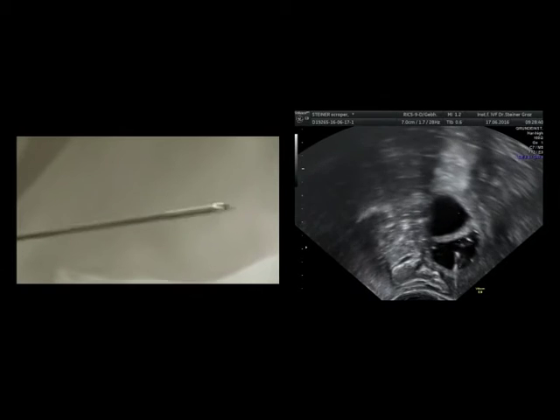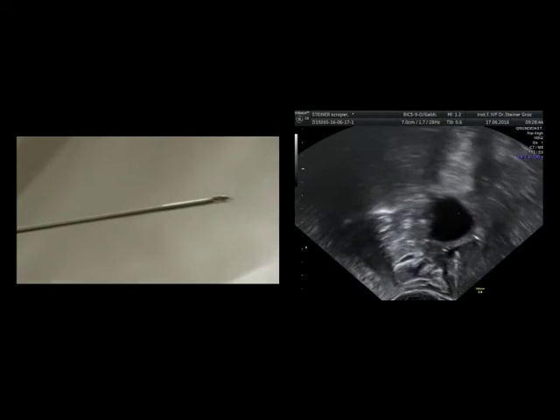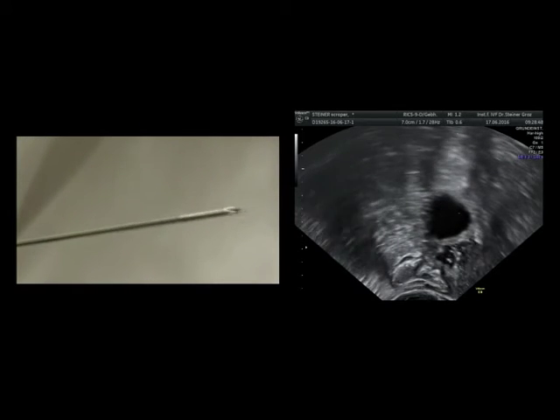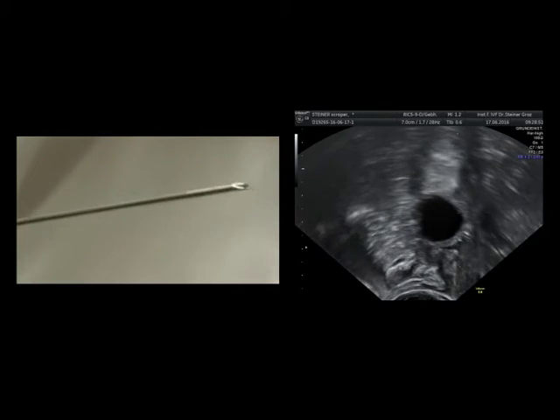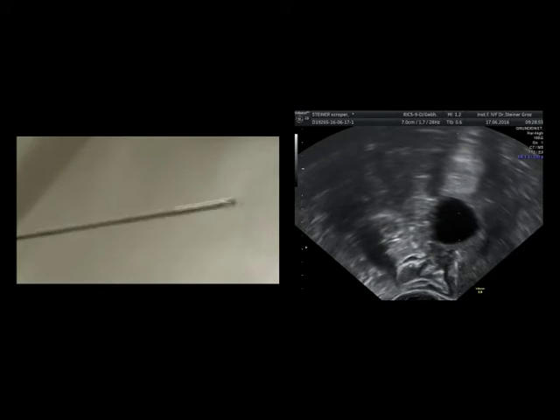Here you can see the tip of the needle. It is important that it is very clearly seen on ultrasound. It is like a blinking movement which you can see on ultrasound.